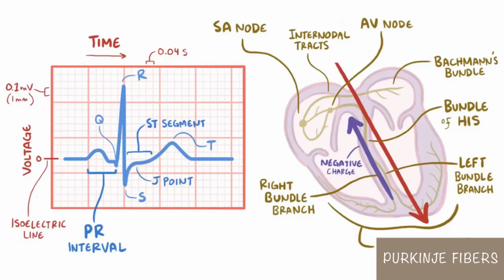The T wave is more spread out over time than the QRS complex because repolarization is a slower process that takes place at slightly different times for each cardiomyocyte instead of happening all at once like depolarization. It's also worth mentioning that atrial repolarization doesn't usually show up at all on an ECG, because the small vectors created by it get lost in the much larger vectors created by the QRS complex.